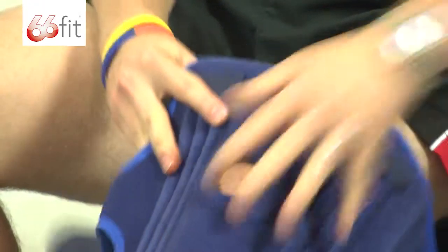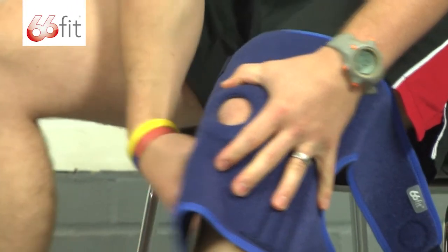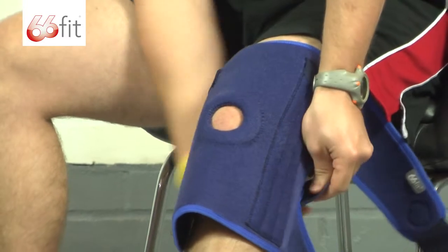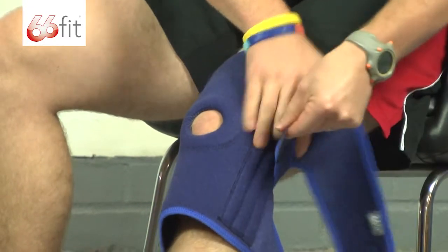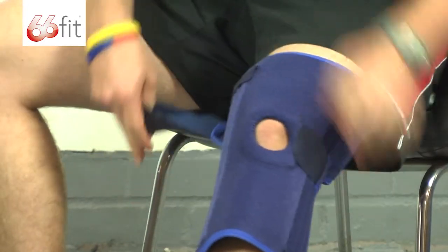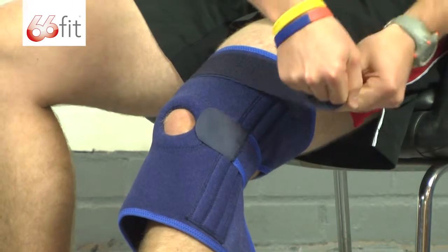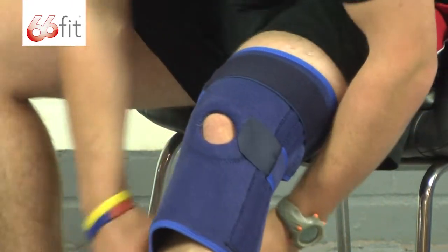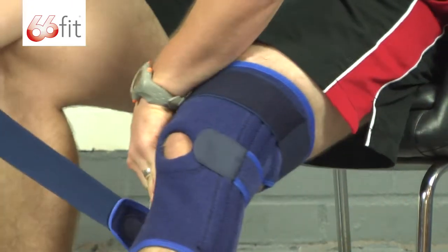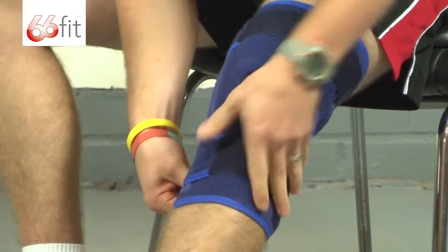Now putting it on — a few tips. Obviously put your kneecap in the opening and always do up the middle strap first. Pass the middle strap round the back and stick it in place. Take the top one, pull that round and stick that down too, and then finally pull the bottom one round and stick that down in place as well.